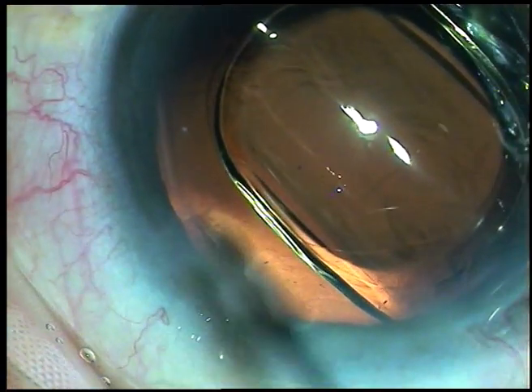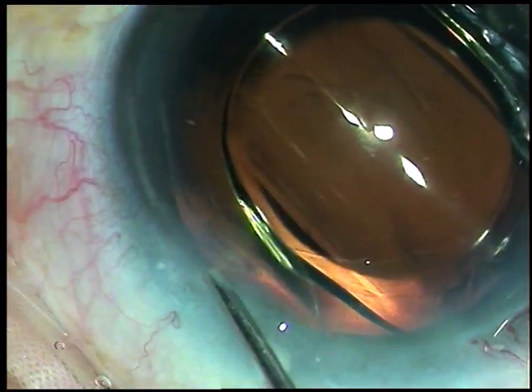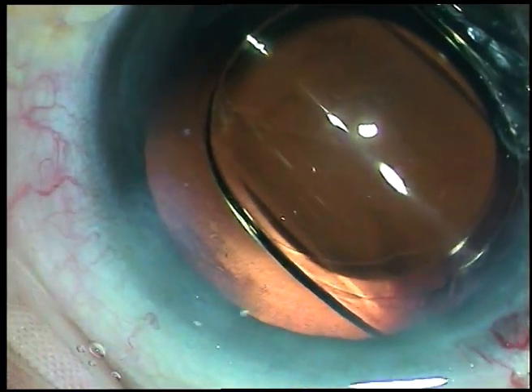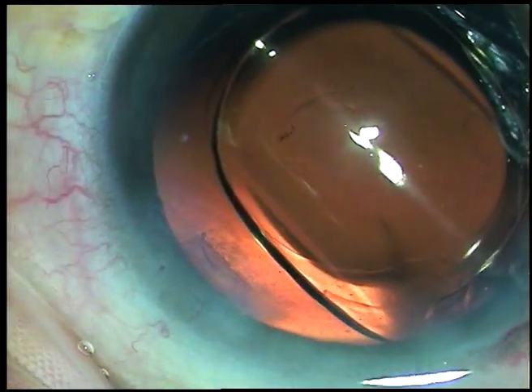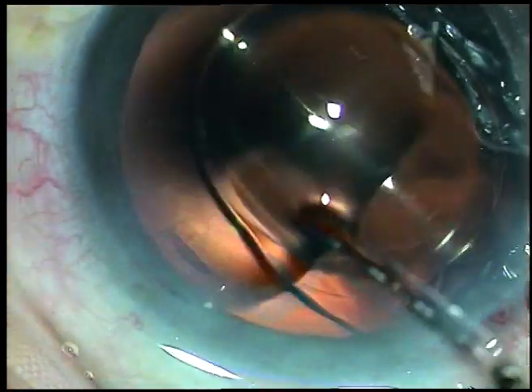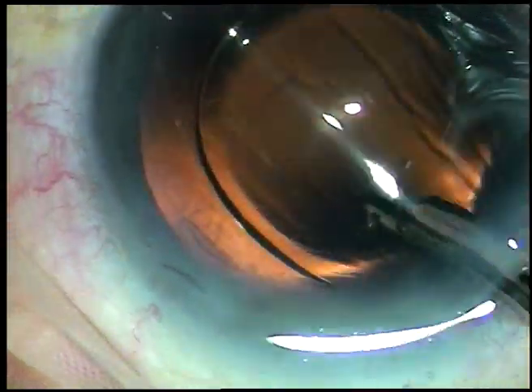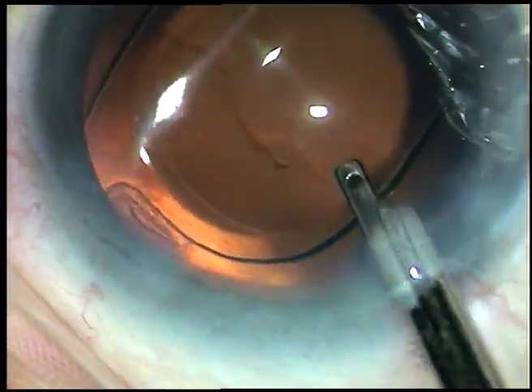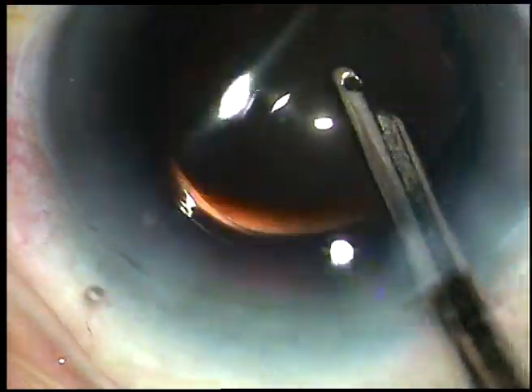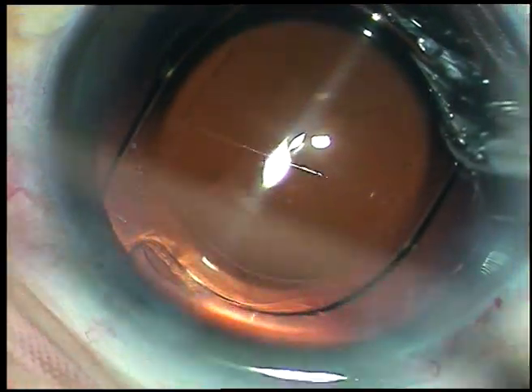A bit of moxifloxacin is applied. The only side port is hydrated with BSS so that this wound becomes waterproof. This is the final lavage of the anterior chamber. The anterior chamber is formed, and the case is concluded.